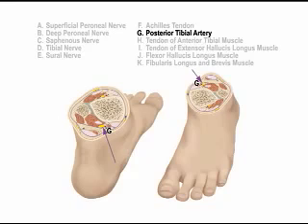The tibial nerve is a motor nerve, which makes its identification with a stimulating needle and a nerve stimulator relatively easy. Please remember that the local anesthetic agents do not cross fascia layers readily, and it is thus important to place the needle in the same fascial compartment as the nerve.